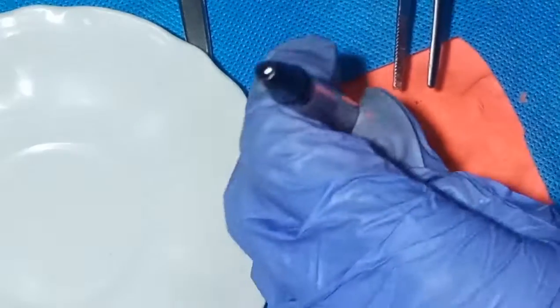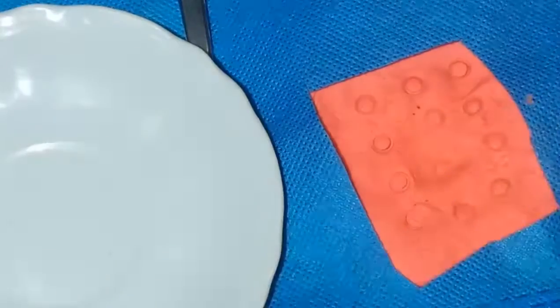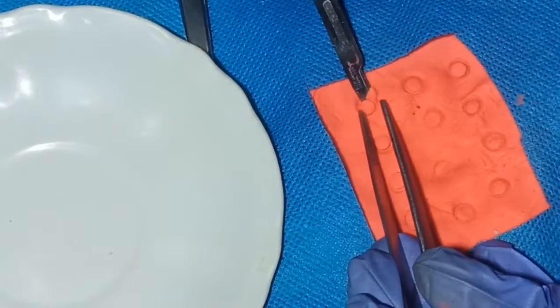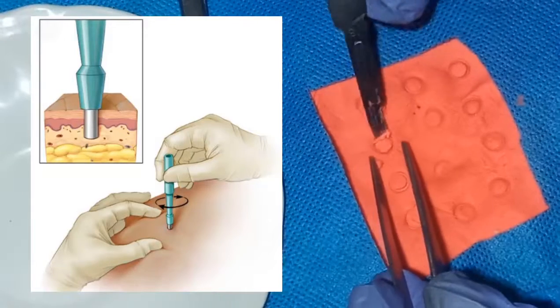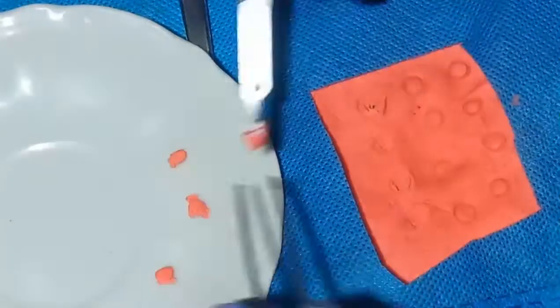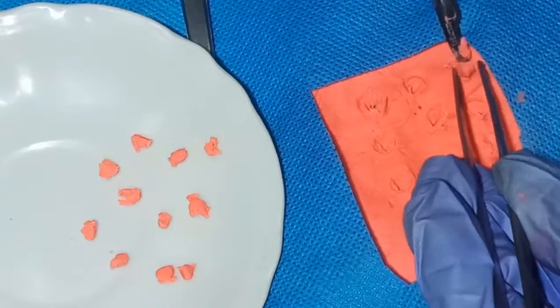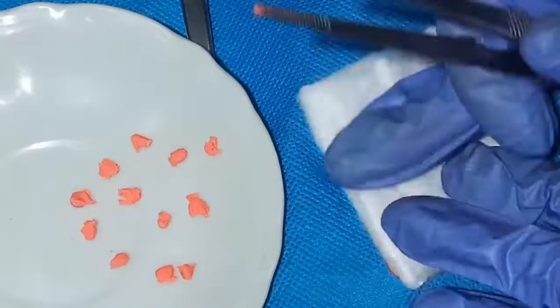Gently pick up the skin with thumb forceps or stay suture and excise a 1 mm piece of skin using a number 15 scalpel blade. Alternatively, harvest a punch graft using a 5 mm skin biopsy punch. Place the punch at the same angle as the hair follicle during harvesting. Make sure to avoid subcutaneous tissues and place the skin pinch or punch in a saline-moistened surgical container.